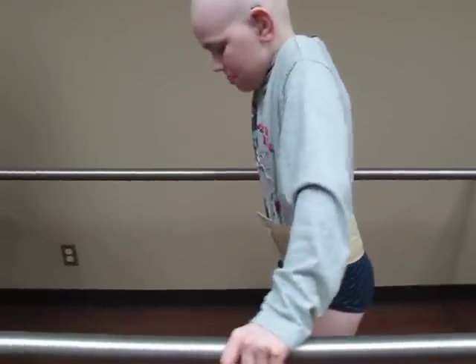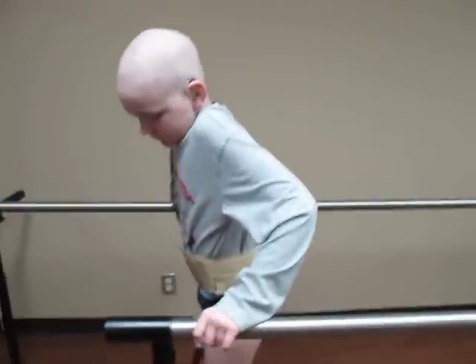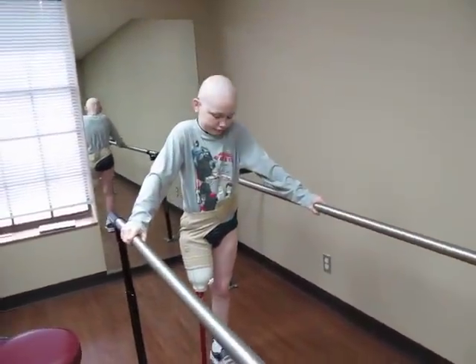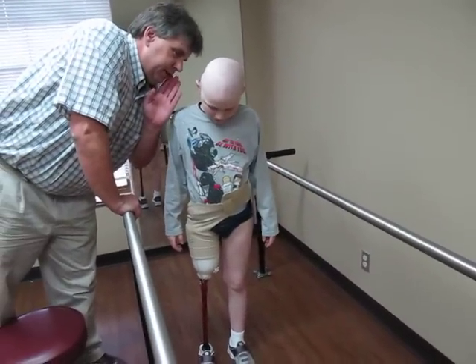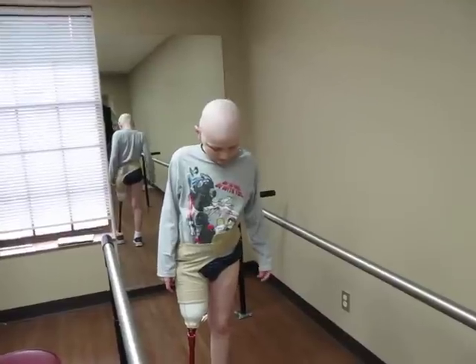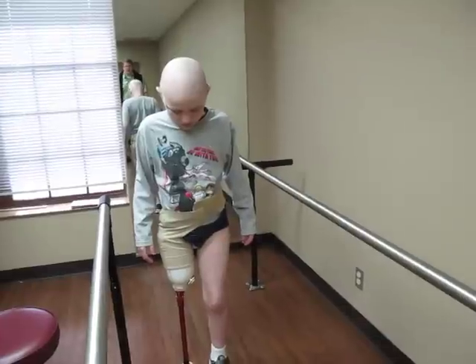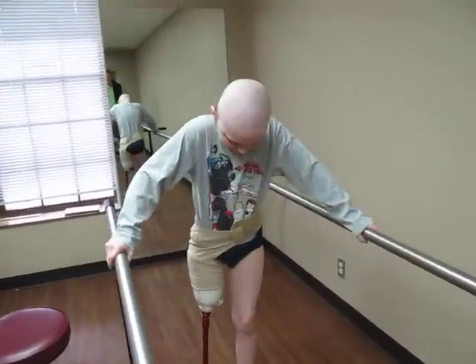You're smiling today and moving, and yesterday this was not happening. Really good. Hey, stand there with your hands. Turn. Just support yourself. Try to use both sides. Truman, you are standing upright with no help for the first time in almost ten months. Bring your leg back. There you go. Good. Just kind of lean on that. Look at me. Very good. Good. Kind of lean into that. Done. That's great. Good job. Good job.